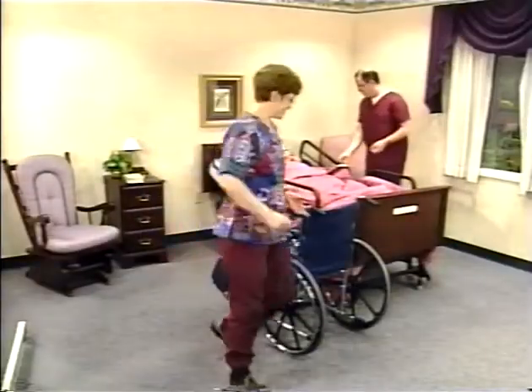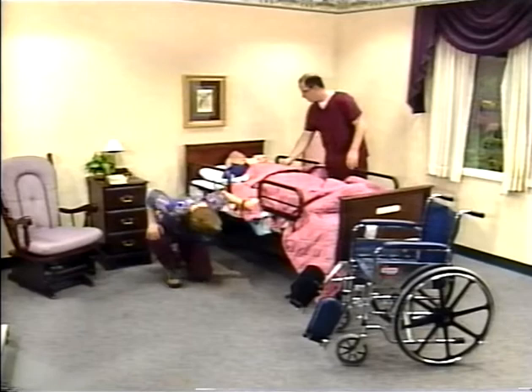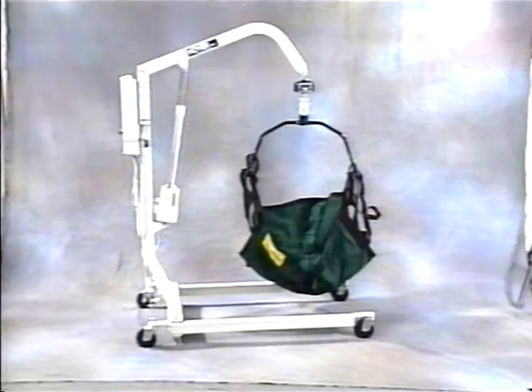Now let's demonstrate a typical transfer from bed to a wheelchair. You've planned your move. There are no obstructions in your path. You have the right lift and sling for the job, and you're ready to proceed. We'll be using the Hoyer Power Lifter.